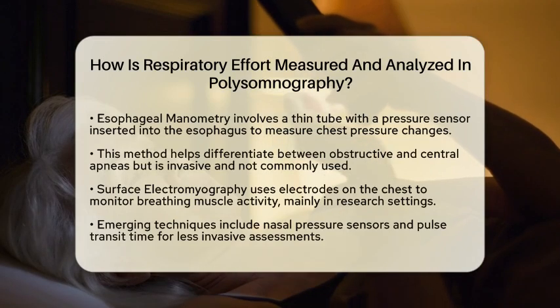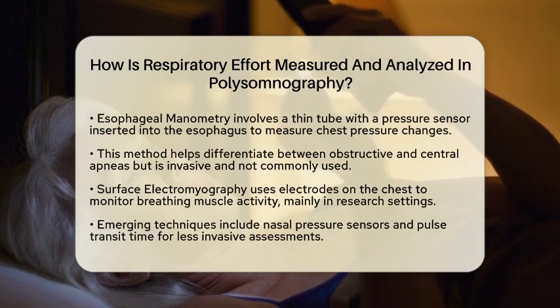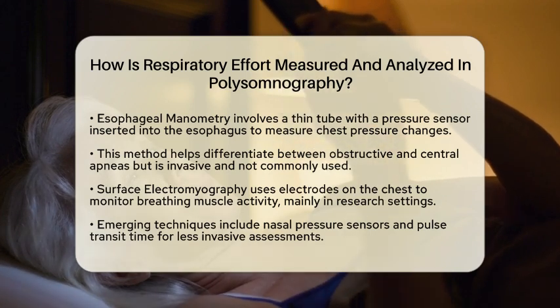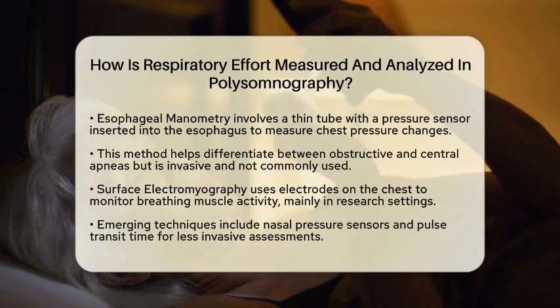This technique involves inserting a thin tube with a pressure sensor into your esophagus. It measures changes in pressure inside your chest while you breathe. This method can help distinguish between obstructive apneas, where you try to breathe but cannot, and central apneas, where there is no effort to breathe at all. While this method is very accurate, it is invasive and not commonly used in routine tests.